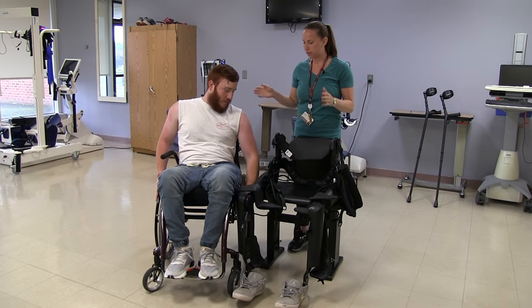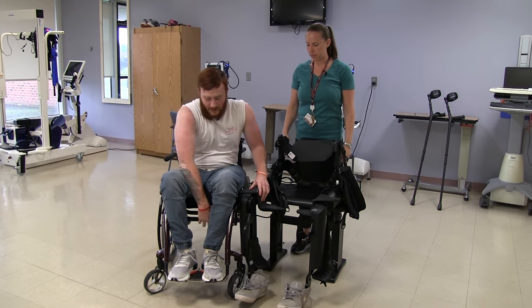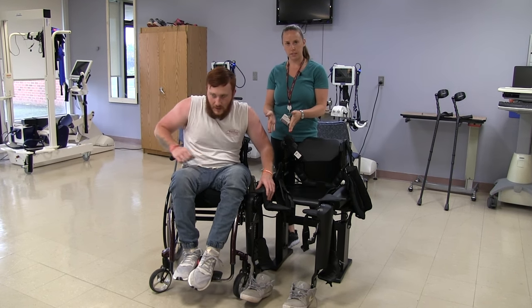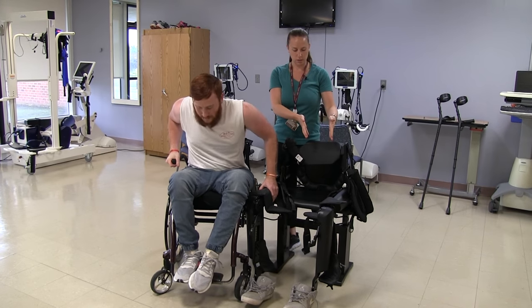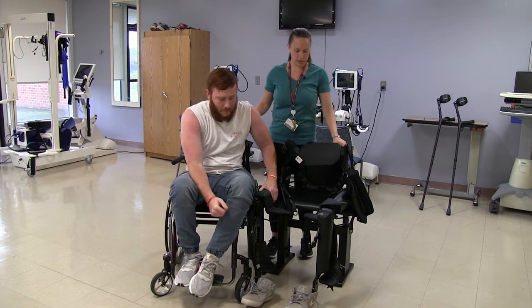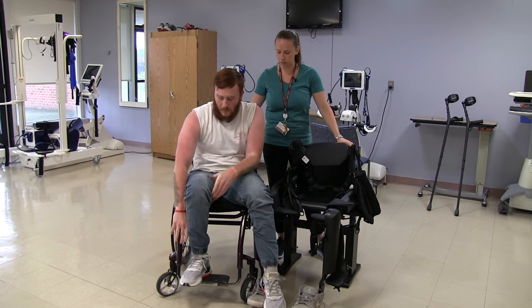Keith is going to transfer from his wheelchair into the ReWalk. Ideally, he's going to transfer onto the right leg of the device and then scoot to transfer all the way in. The therapist is guarding the device and maybe assisting Keith a little bit if needed, but he's pretty good.